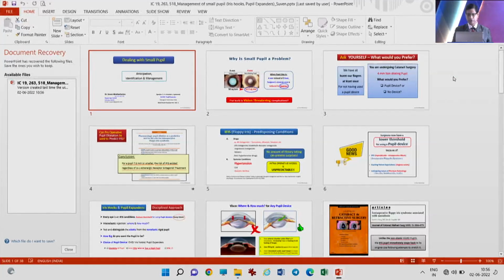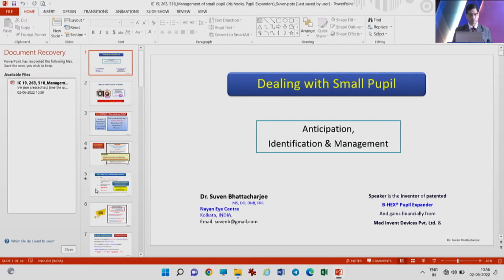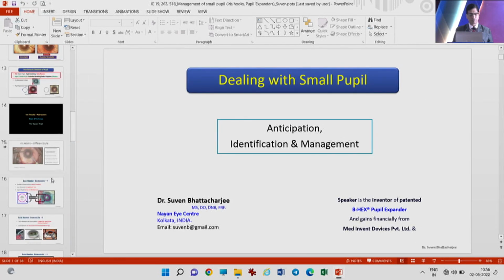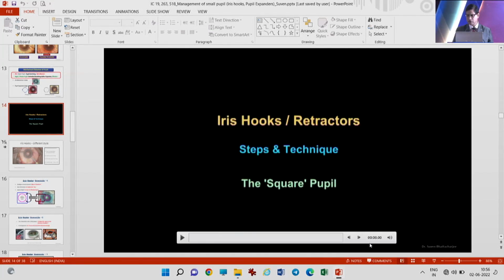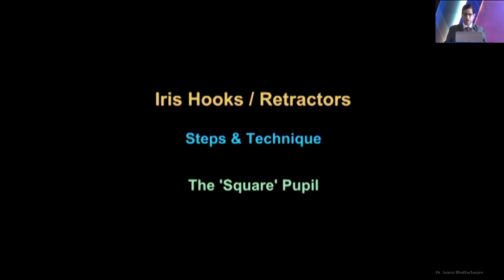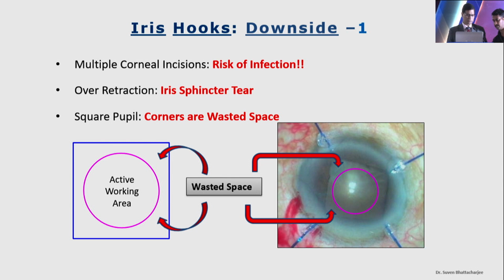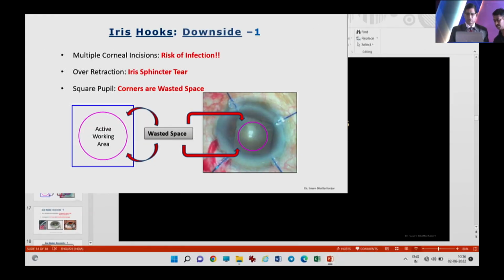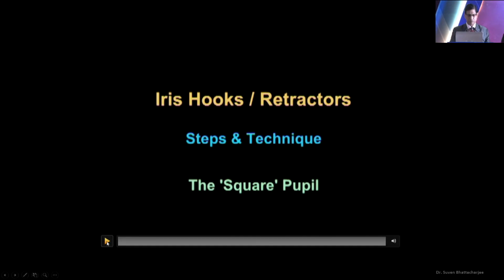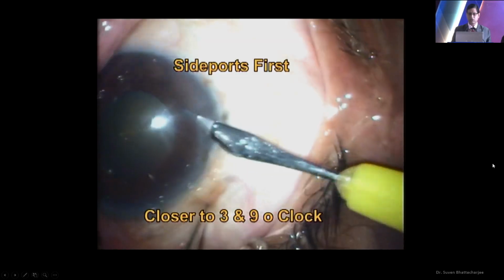I'll come to that slide, don't worry. I'll let that video run without any interruptions so that we don't have a mess. Okay, go to duplicate sites. Again, the same problem. Okay, so I'll not touch this video now.